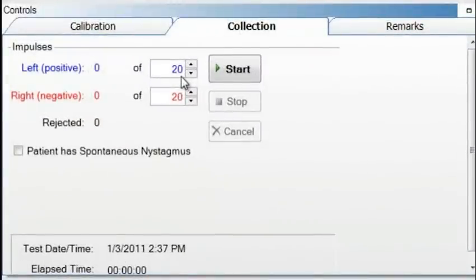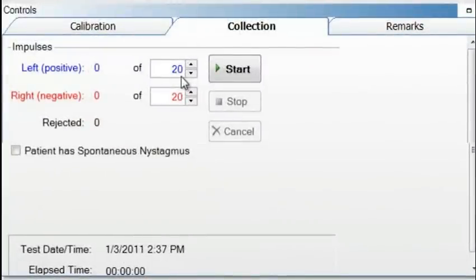The impulse settings define how many valid left and right impulses are required before the test stops automatically. Here you see 20 left head impulses and 20 right head impulses. To change the number of suggested minimum head impulses for the current testing session, click the up and down arrows or type the number in directly.